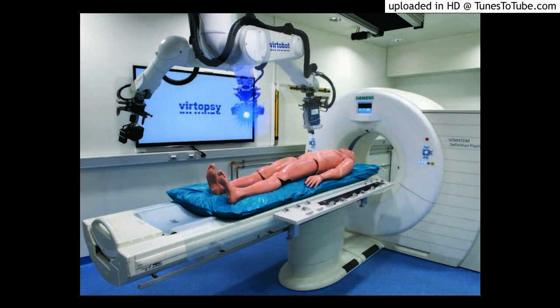Methods of virtopsy. Computed tomography. CT is the most frequent imaging tool in forensic sciences. With modern scanners, 2D and 3D reconstructions based on slice thicknesses of 0.5 mm are not only possible, but are becoming routine standard. It is used for detection of foreign bodies, fractures, gas, and fluid accumulations such as blood.